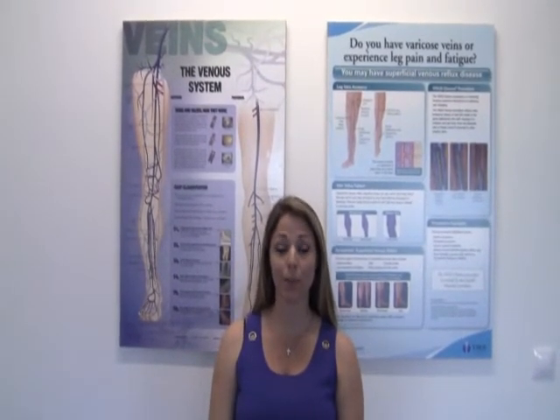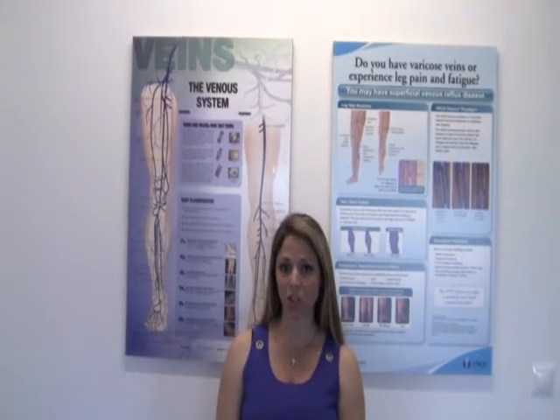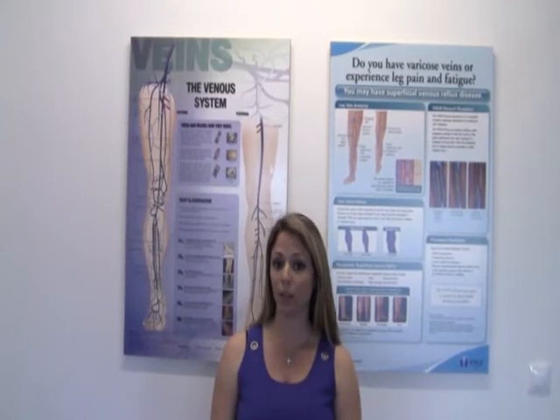Over the last decade or so, new techniques for the treatment of varicose veins have been developed. The focus is now towards minimally invasive procedures. The two techniques I would like to discuss are endovenous laser therapy and radiofrequency ablation. The principle behind both techniques is the avoidance of large incisions in the groin and ankle areas. The greater saphenous vein is rendered non-functional but not removed. The advantages are quicker recovery, a lot less pain, and minimal bruising.